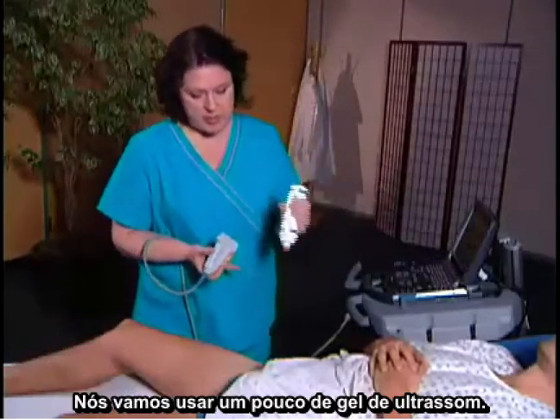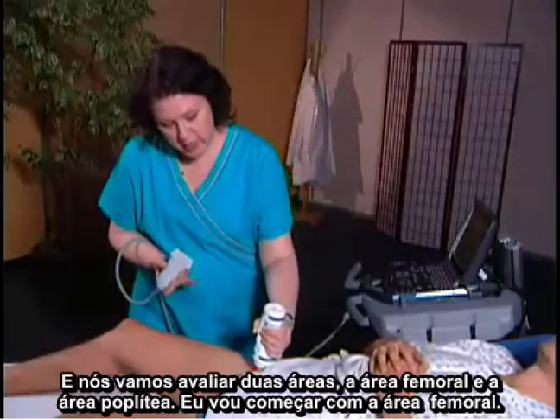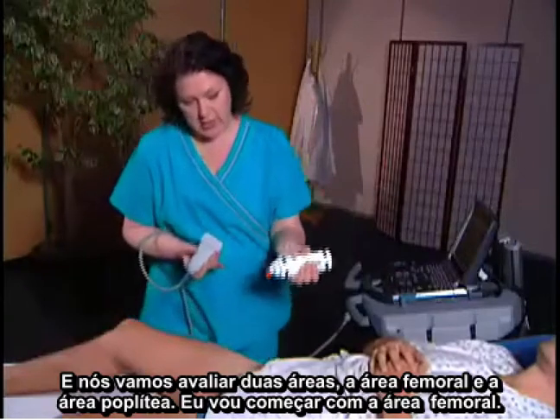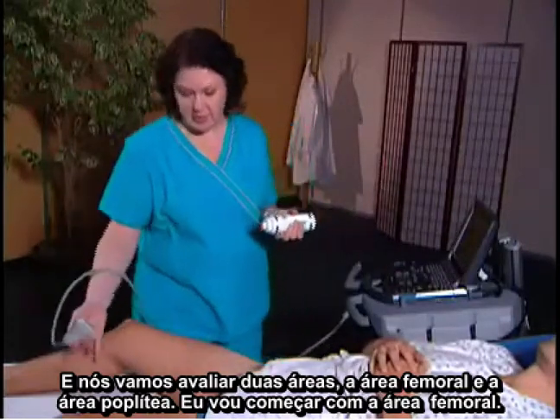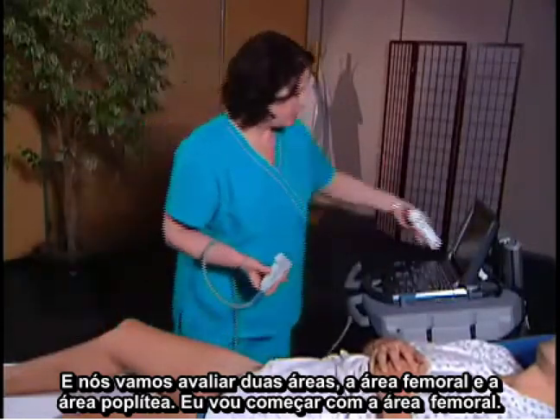We're going to use a little bit of ultrasound gel, and we're going to assess two areas: the femoral area and the popliteal area. I'm going to start with the femoral area.